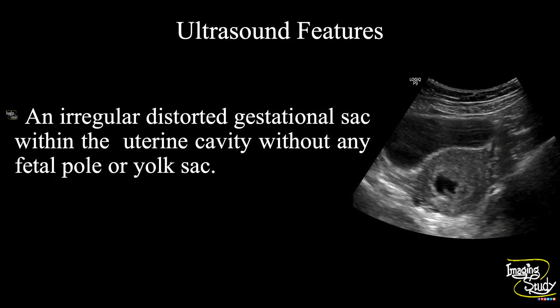So in summary, an irregular distorted gestational sac is noted within the uterine cavity without a fetal pole or yolk sac, indicating this is an incomplete abortion.